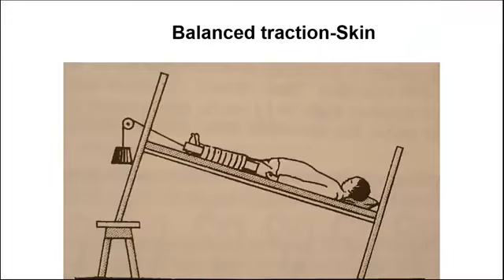This is, of course, balanced traction, which is a combination traction method where you have skin traction, you have a pulley, elevation of the lower side of the bed, particularly in children.